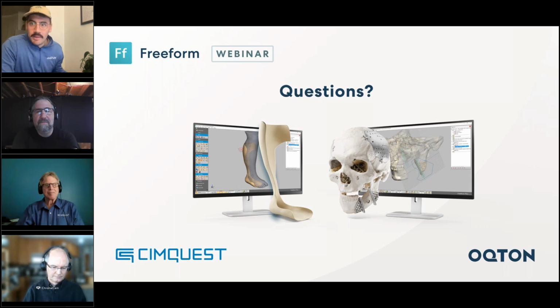I don't think we have time for any more questions. There is a nice comment to end on. We have a user here that has just put in the chat that they've been using Freeform for almost 15 years and are very, very happy with it as a product. Great to hear. Any other questions that haven't been answered throughout this webinar?